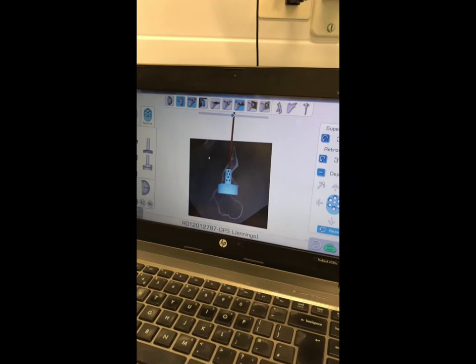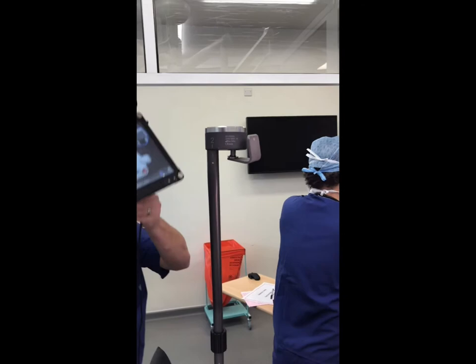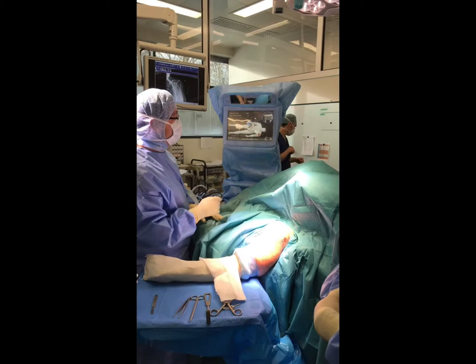In terms of the initial setup, we need to ensure that the navigation screen and sensor has an unobscured view of the sensor, which we'll subsequently place in the coracoid of the patient. We've got a sterile drape over the screen, so I can touch that if necessary.